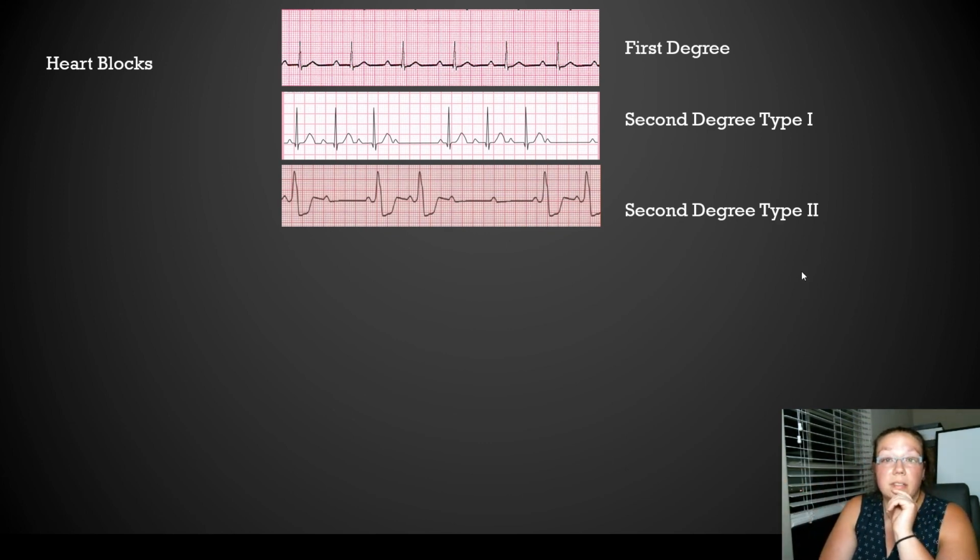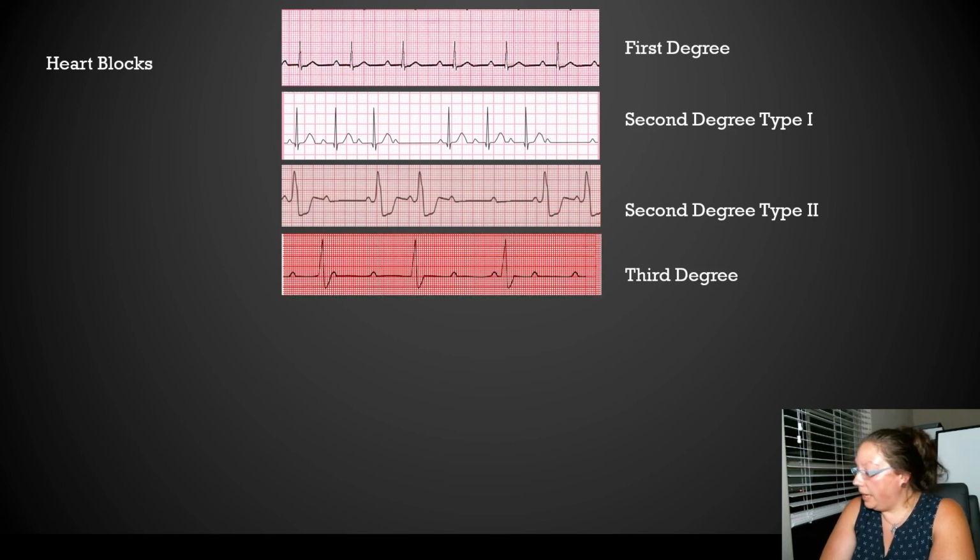This is the more dangerous of the two because your rate may not be as effective. You have P wave but no QRSs, and the QRSs are what pumps the blood to the rest of the body. So if you don't have QRSs, you're not pumping blood. So P wave, QRS comes home to P wave one night, another night, and then just doesn't come home. Well, now P has had it, absolutely had it, and now they're separated. P's like, you know what? You don't come home on time, I'm done with you.